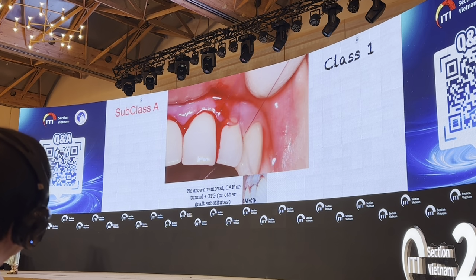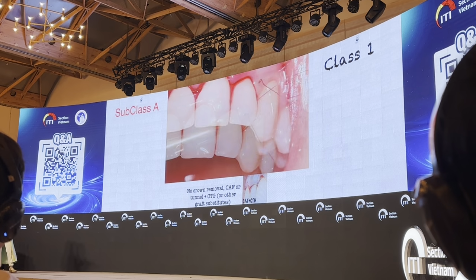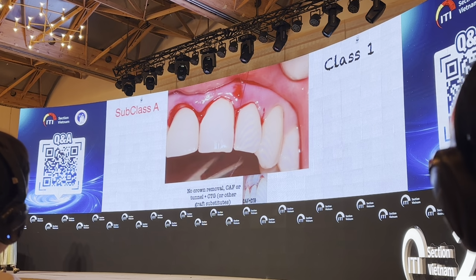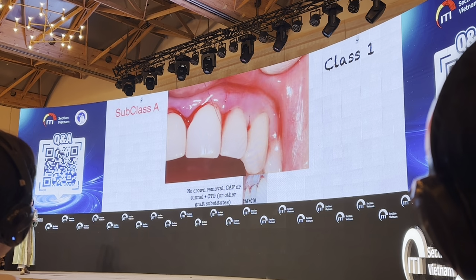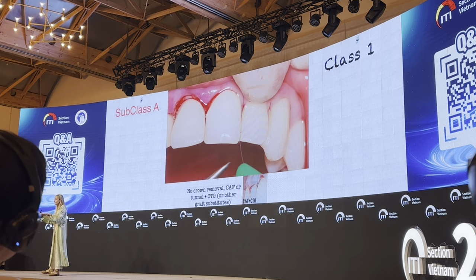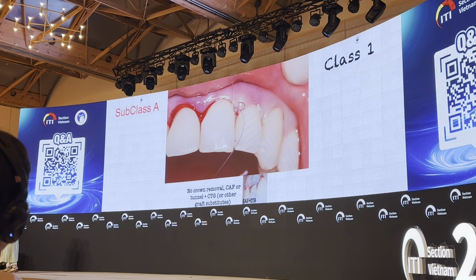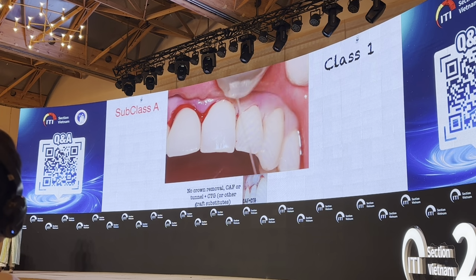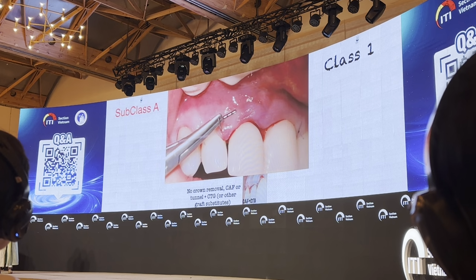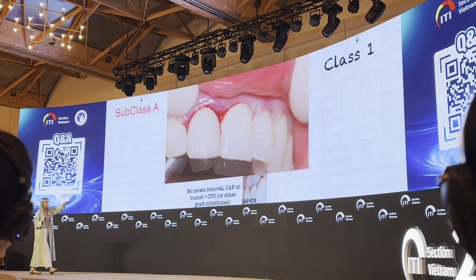And now, with the suspended sling suture, I tightly adapt my surgical papilla above the anatomical disepithelialized papilla that will represent the vascular bed for the surgical papilla. So the triangular shaped surgical papillae are adapted above the anatomical ones, and with the sling suture, I'm capable to tightly adapt the margin of my flap around the convexity of the teeth and around the convexity of the implant supported restoration.